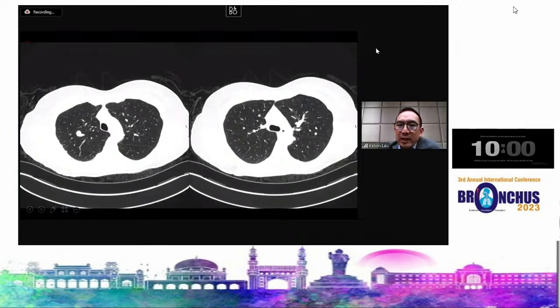Another situation: this is another patient with a colorectal metastasis. There's one here, right on the fissure on the left, so that's easy to find surgically. The other one is deep inside the lobe, exactly between all 3 segments. It's not like you can even do a segmentectomy. It's too deep for a wedge for metastasis. So this is a good illustration of what having multiple tools can do.